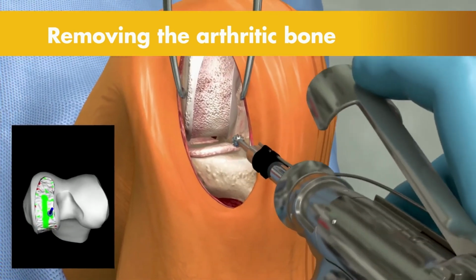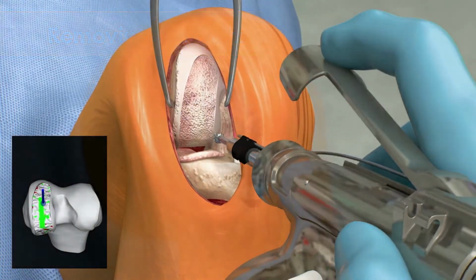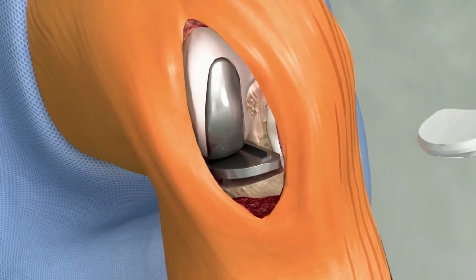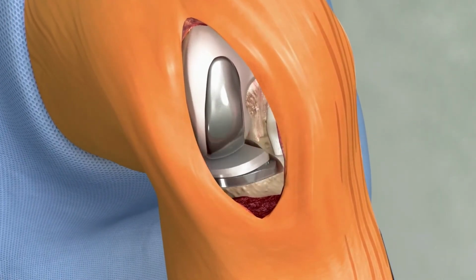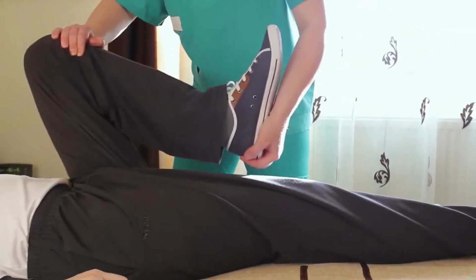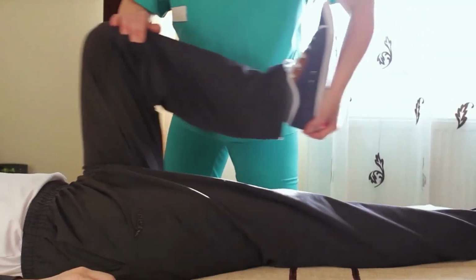Collectively, these cues help the surgeon stay on the preoperative surgical plan. With the diseased bone gone, a partial knee implant is inserted into the joint space. And once the surgeon is comfortable with the knee's movement, it's off to the recovery room to begin the journey towards strengthening the knee joint.